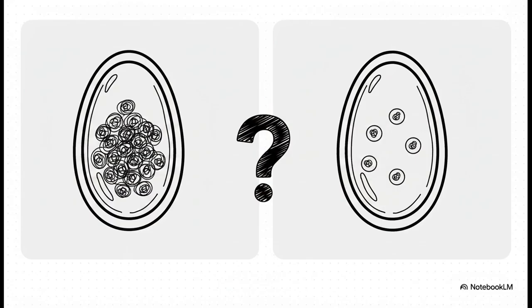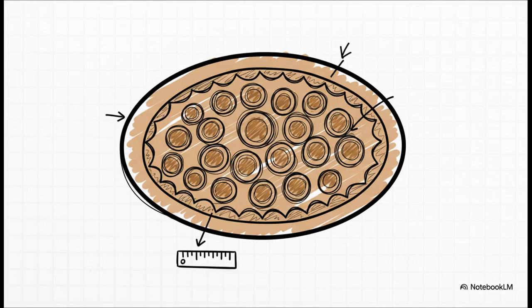Plus, you can verify your count with a quick measurement. Haemonchus is slightly longer at 86 micrometers compared to the hookworm coming in at 74. Let's summarize. For a definitive Haemonchus contortus call, lock these traits in. Oval shape, thin smooth shell, light brown. But the absolute deciding factors? Measuring that 86 micrometer length and confirming strictly more than 8 blastomeres packed away within that delicate internal yolk membrane.